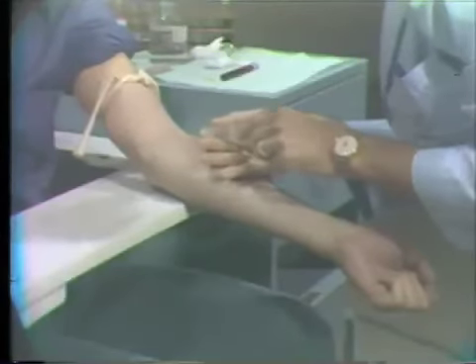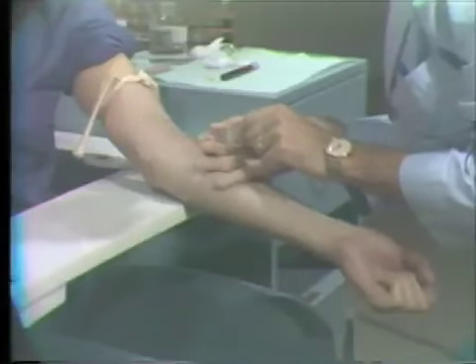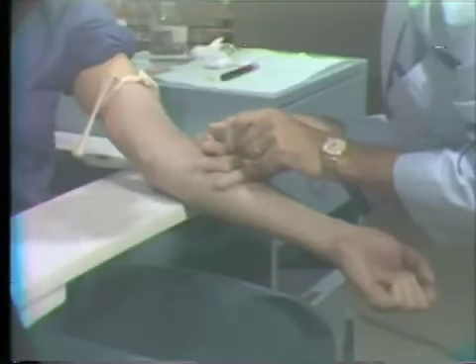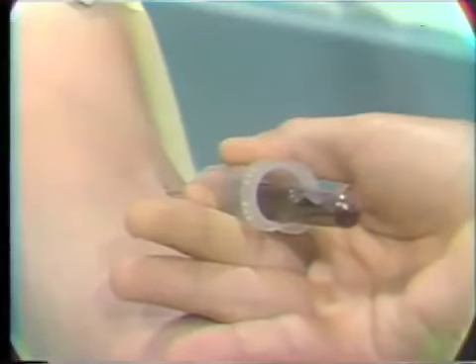I will then place another Vacutainer and again press it home into place, and we can draw as many tubes as we want. This way you can draw 1 tube for hematology, 1 tube for coagulation, 1 tube for biochemistry.